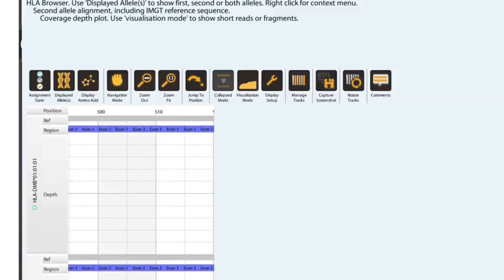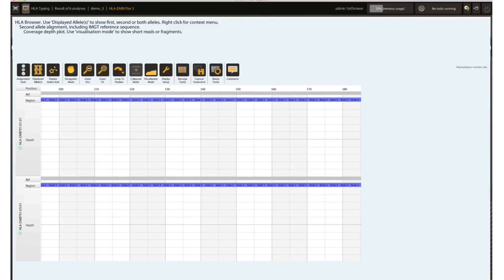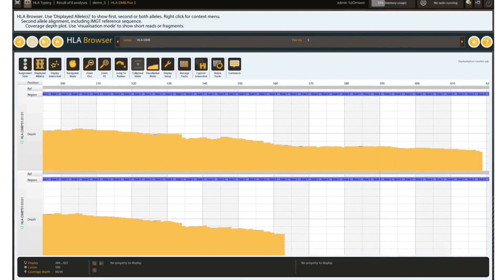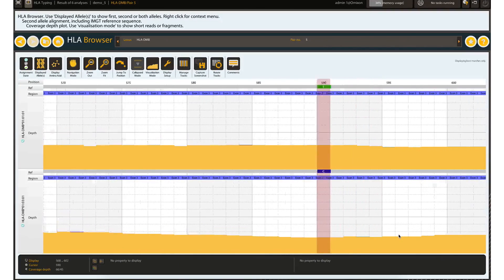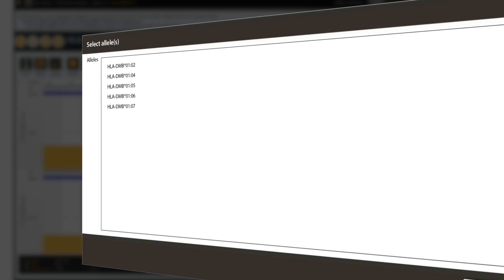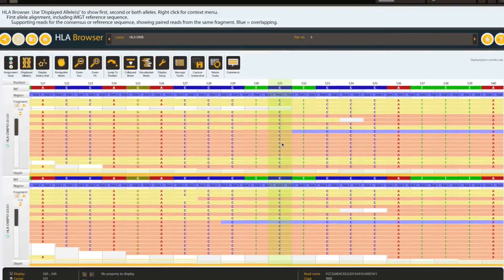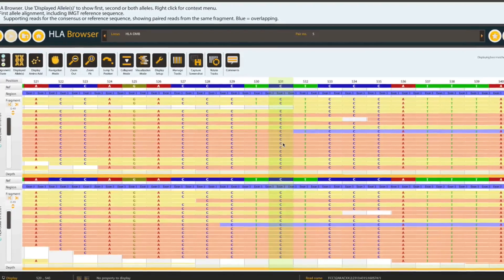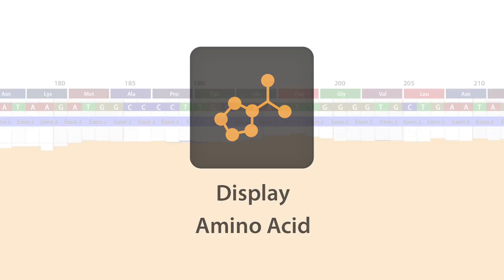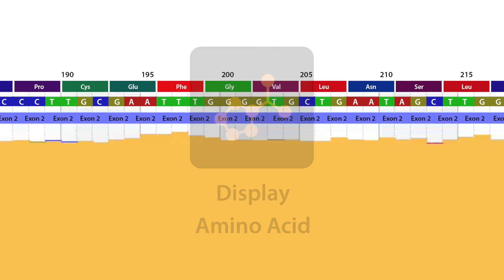For a visual exploration of what's in your underlying sequence data, HLA-Explore features a powerful genome browser. In the genome browser, it is possible to highlight heterozygous positions for the exons, compare alleles, inspect the reads and fragments individually, and display the corresponding amino acid order for every locus that has been genotyped.